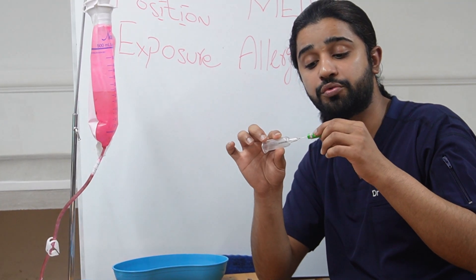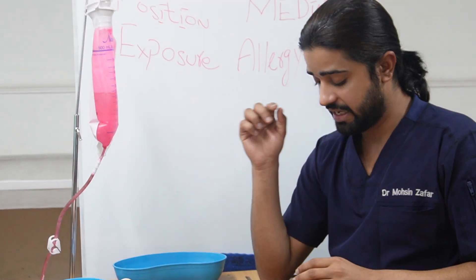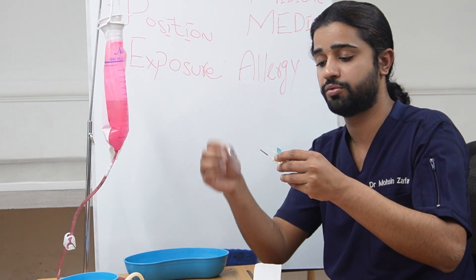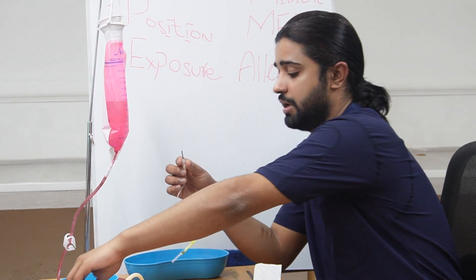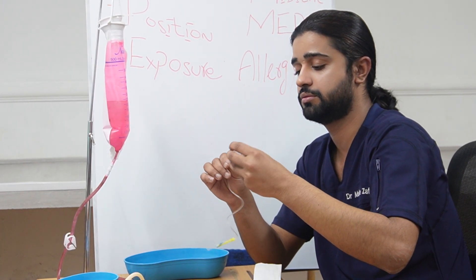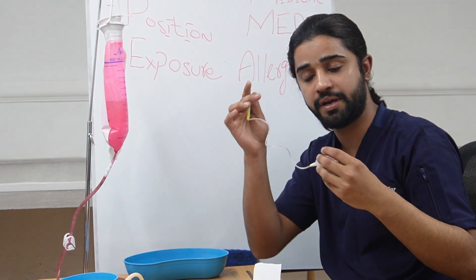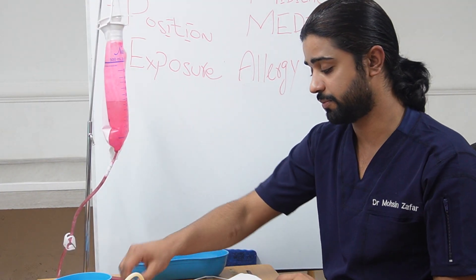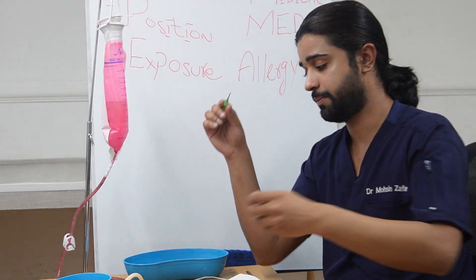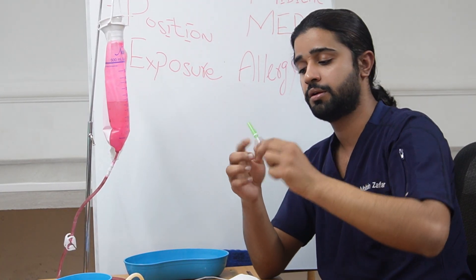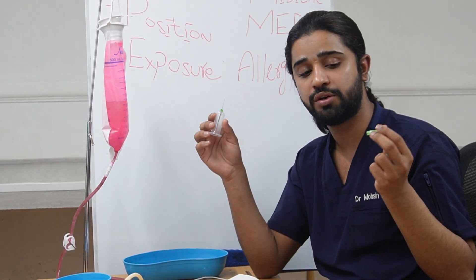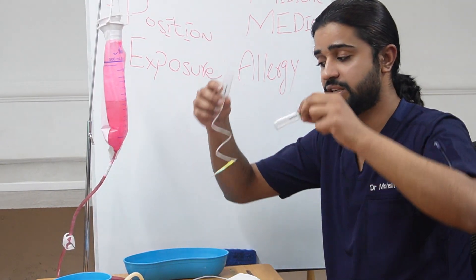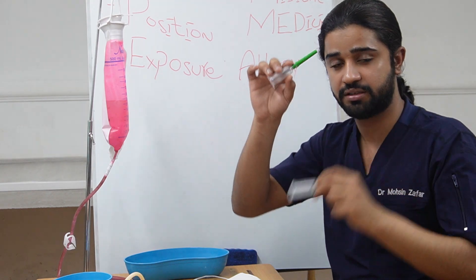The second type is a butterfly needle — take it out, attach it to the Vacutainer like this, remove the cap, and use it. The third technique: take the white cap out, attach it to the Vacutainer, take the cap out, and then you can use it. So there are three types of needles: two you need to attach yourself and one comes already attached.